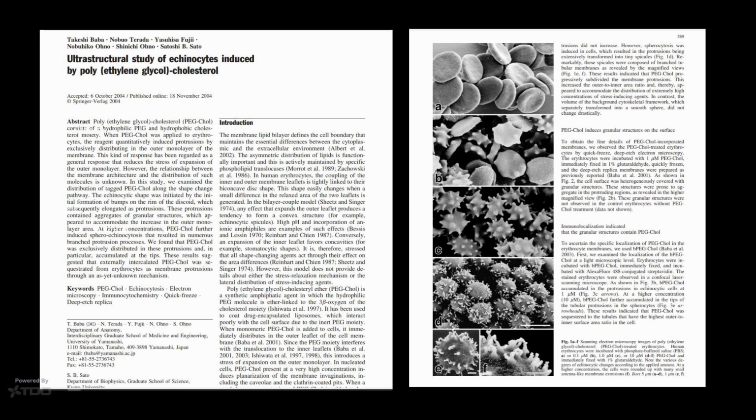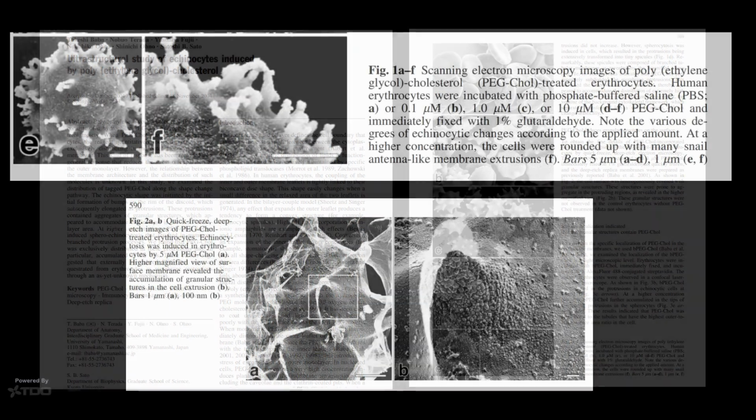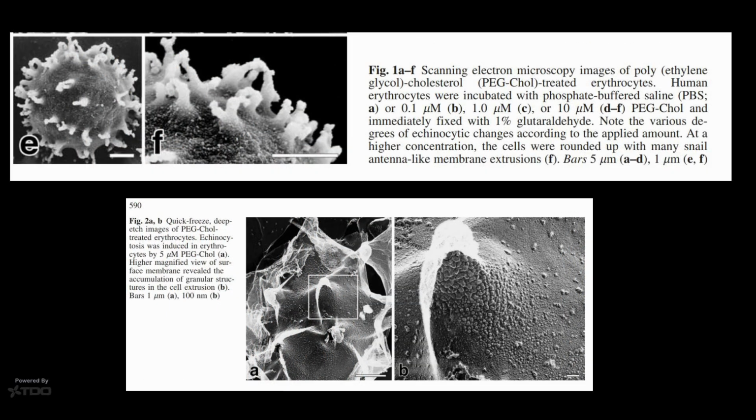So when you have the activation by the laser of the ethylene glycol, it affects the outer membrane very, very quickly. And that's why there are so many of these echinocytes in Reed's cases where sweeps was used with the Triton. So now it's making even more sense for why we are seeing this only in Triton cases.